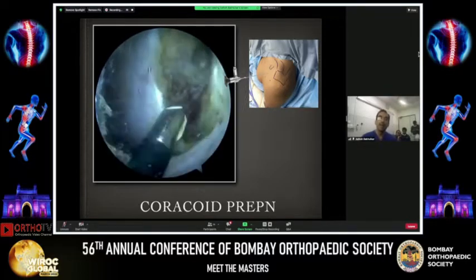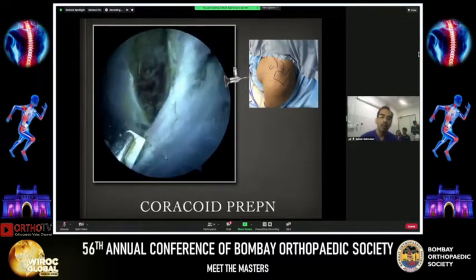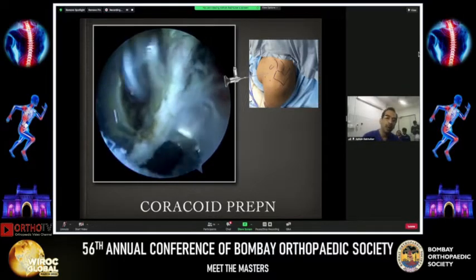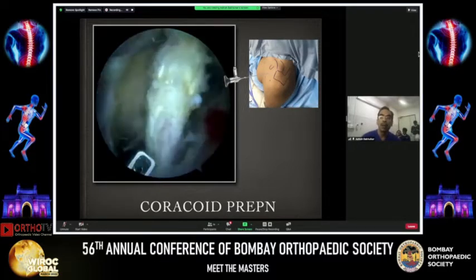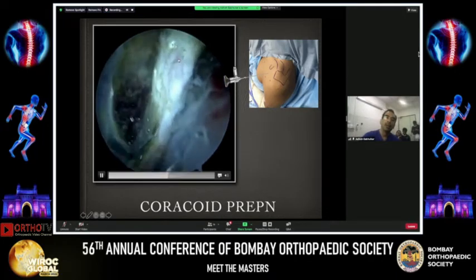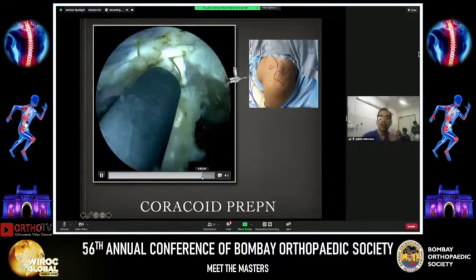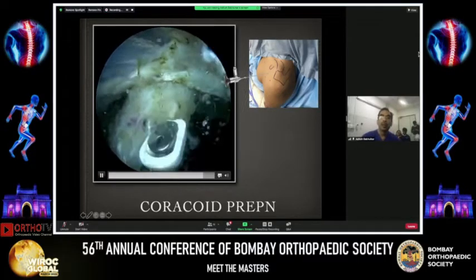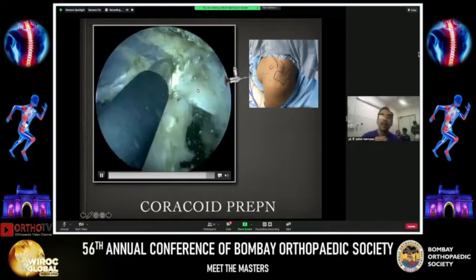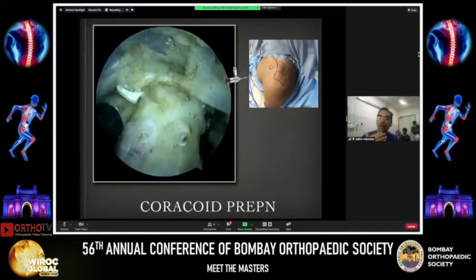Once we have mobilized this nicely under vision, scope still in the anterolateral E-portal, we are removing all these tissues — the entire clavipectoral fascia that is obscuring your view. At the same time we have an excellent view of the conjoint tendon, which is hanging onto the promontory of the coracoid all the way down. There is also an enlargement of tissue on the back end of the coracoid; it's an extension of the biceps and it is not important.